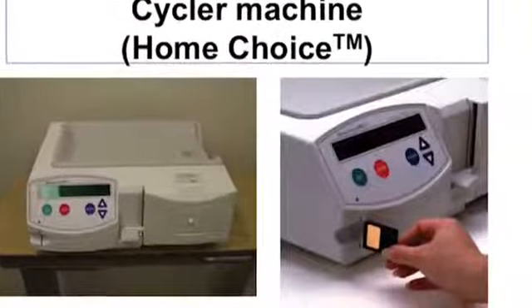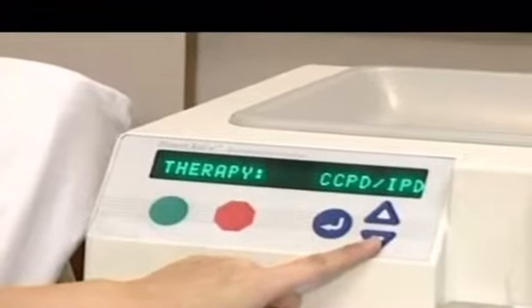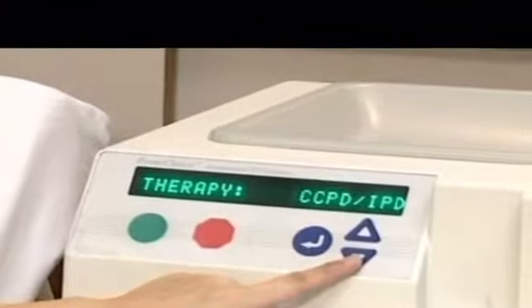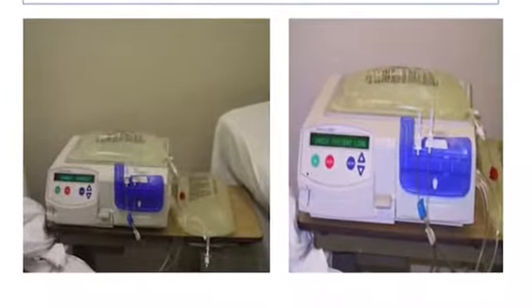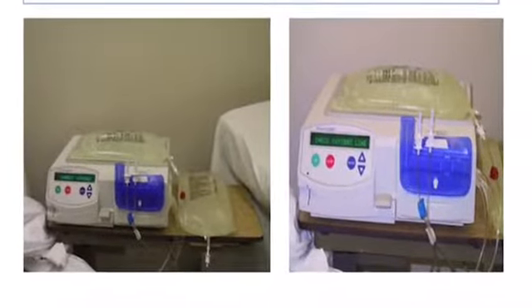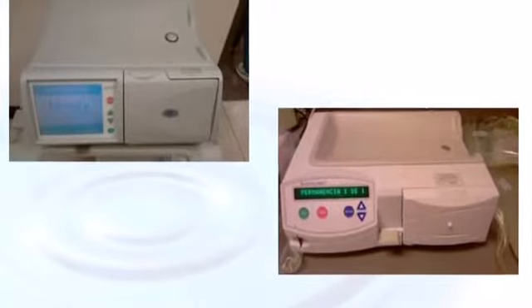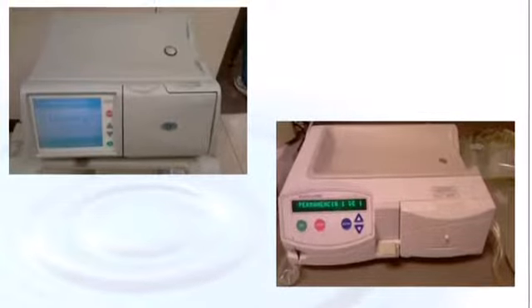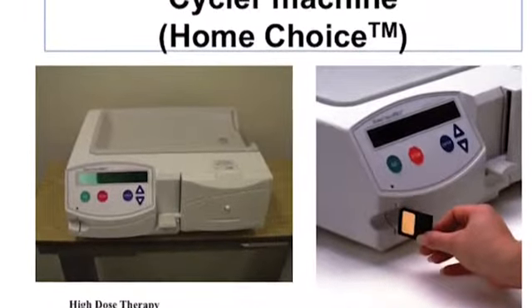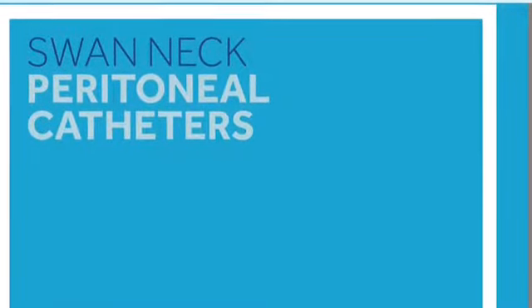The rationale for choosing it is a simple setup and operation using a small portable machine. It is adaptable to the patient's home environment or for travel. The patient has greater daytime freedom, and it is definitely suited to the patient who still manages to work in the daytime. It is less hassle, and the patient will be able to cope with the daily routine without the worry of doing dialysate exchange during the day. Patients on CCPD had significantly lower peritonitis rate compared to continuous ambulatory peritoneal dialysis.